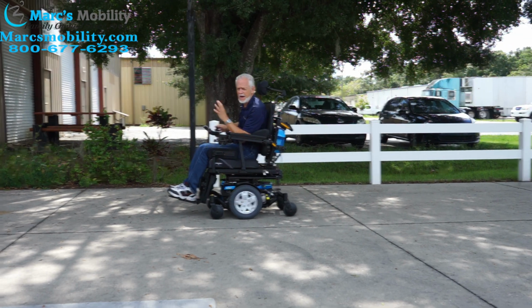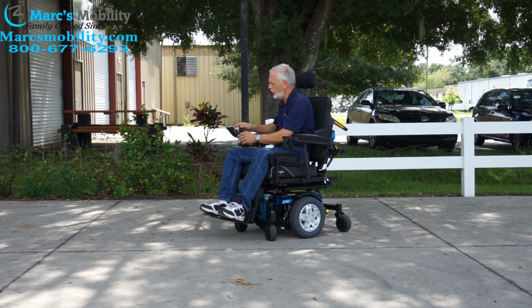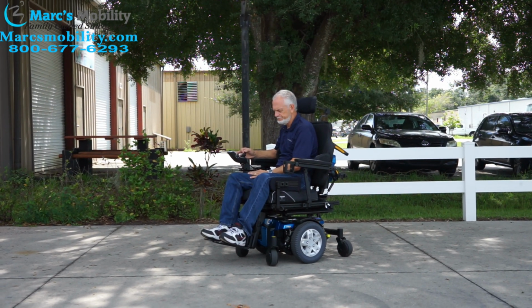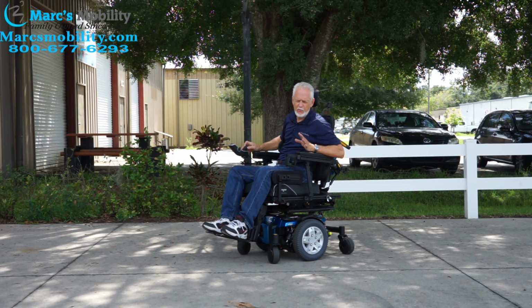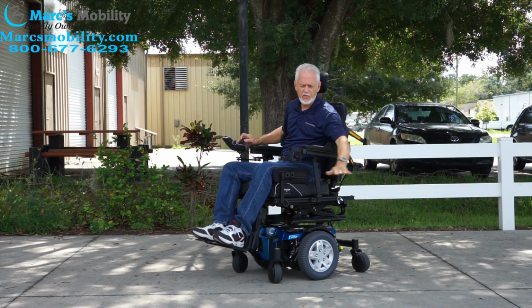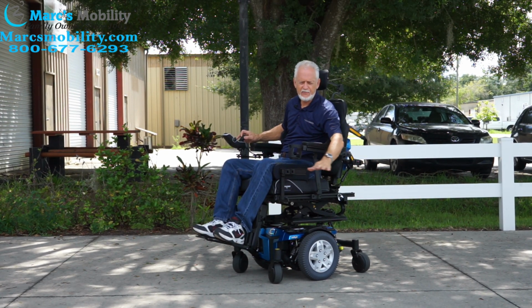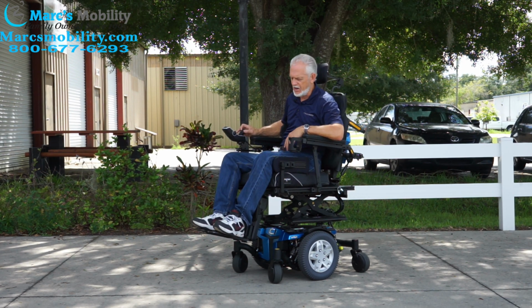So this chair has 4 miles. It's practically brand new. I'm going to elevate the seat right here just to show you what it looks like with the seat elevated. The seat is going up right now. So remember, when you use the seat lift, which is going up now, keep it on flat surface in your house, completely flat, not sidewalks where they're cracked. These are nice chairs, but you do have to take care of them.